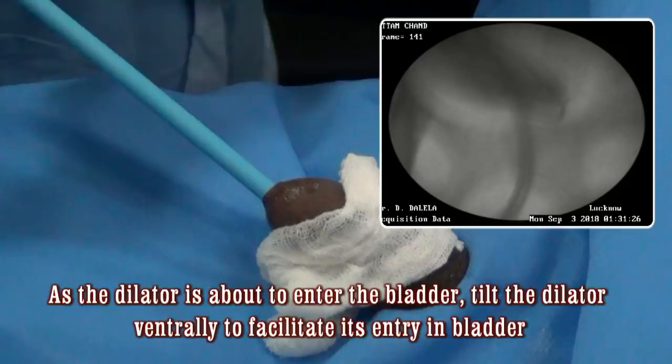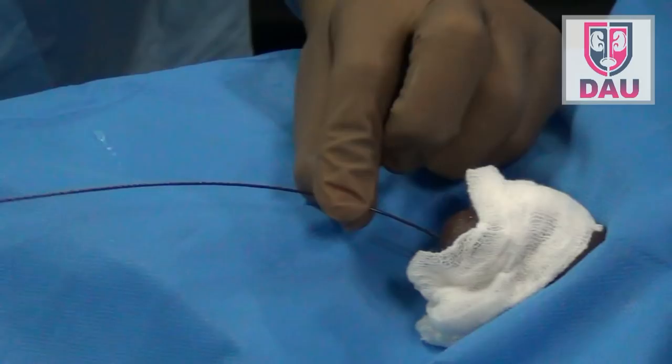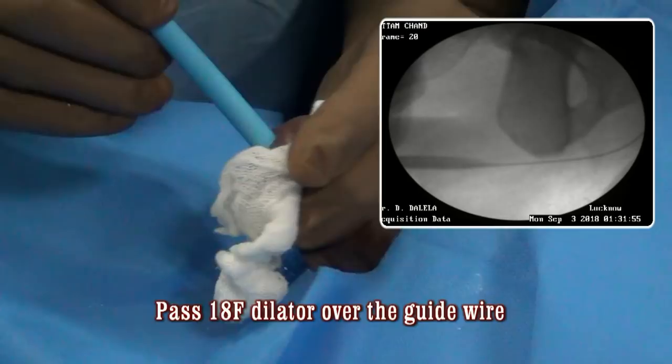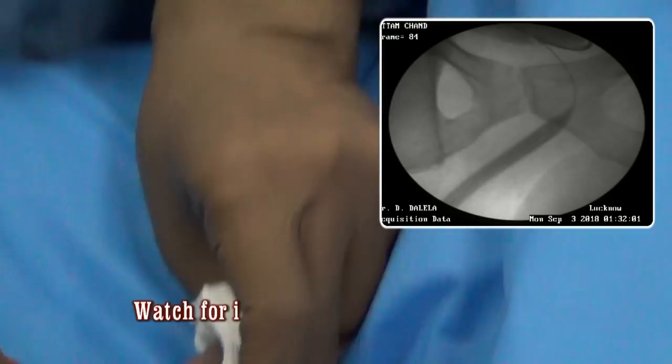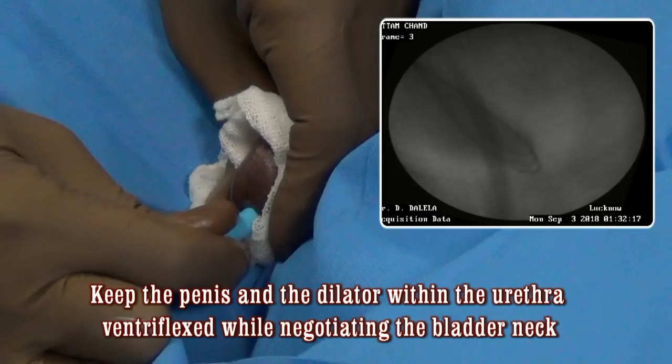Withdraw this dilator and now pass the 18 French dilator. You may not pass 18 French in everybody — 16 French is reasonable — but in this case we decided to go up to 18 French. As you pass thicker dilators at the prostatic urethra and bladder neck, you have to bend the dilator and be very careful not to injure the bladder neck. Just maintain steady pressure and the dilator will find its way into the bladder. Give some angulation and that is what you need.